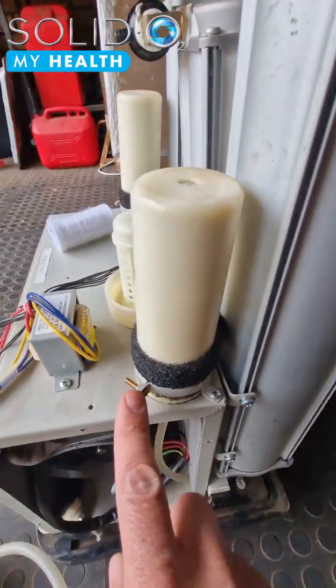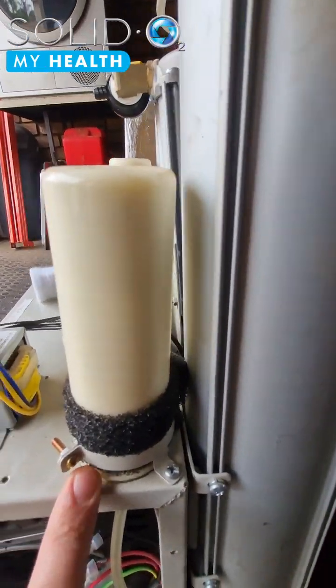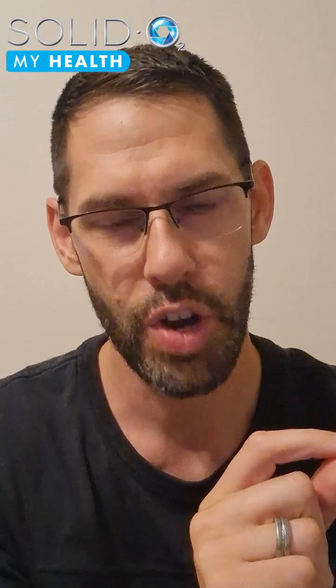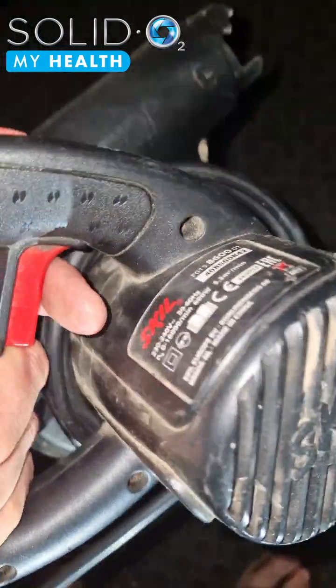While many concentrator models may look different, they have very different quality components on the inside. But the good news is the functionality is very similar. So what will you need to service your concentrator? Most likely you can get away with just a screwdriver and a decent blower, not your hairdryer. Get yourself a decent air blower.